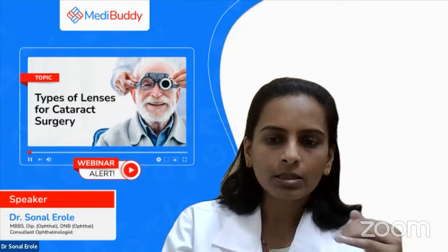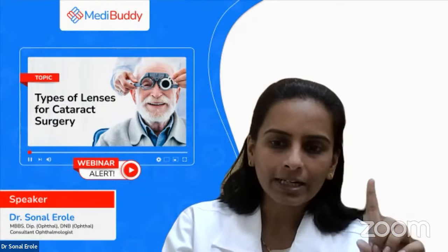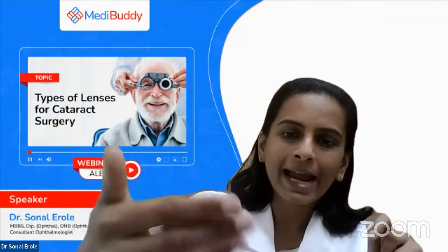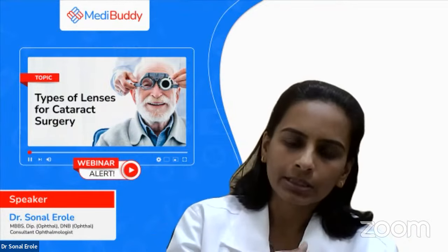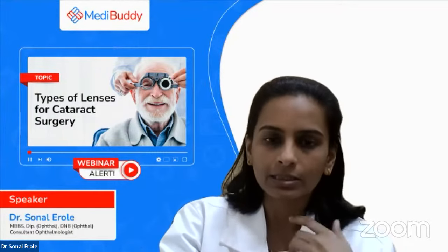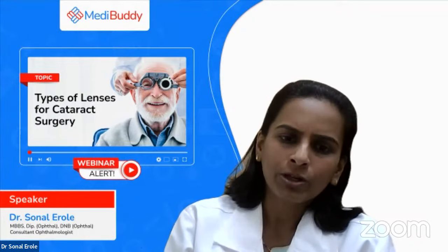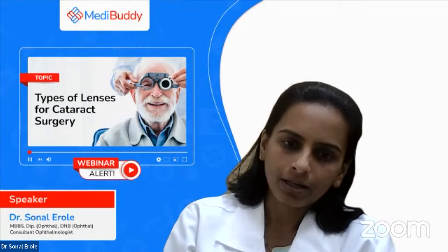So what happened with this? The scientists came with a newer concept, the EDOF lens, that is, extended depth of focus lenses. What does this extended depth of focus lens do? Basically, these lenses will cover your distant vision and the intermediate vision. Intermediate vision means almost a 40 to 60 centimeter distance. For reading at their reading distance, that is 30 centimeters, they will need to wear glasses of just 1.5 or so for near reading. All the rest of the work they can do without their glasses.